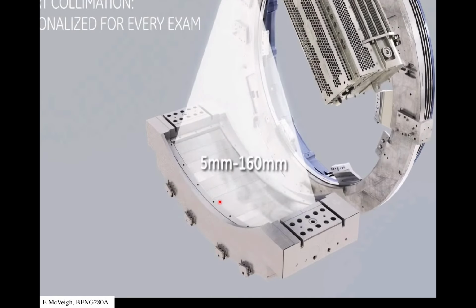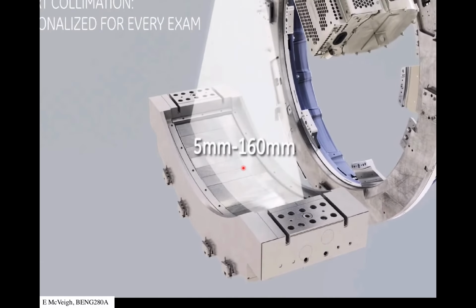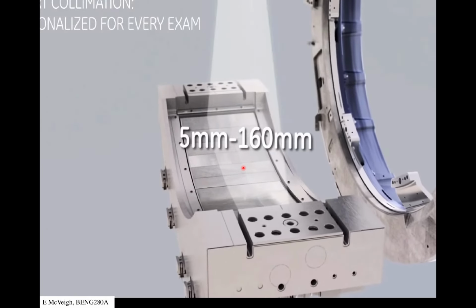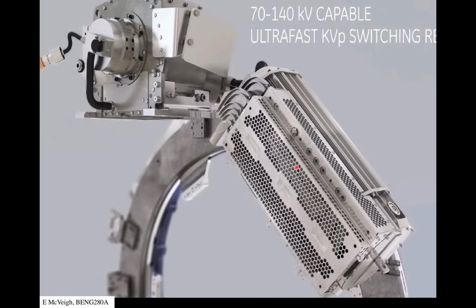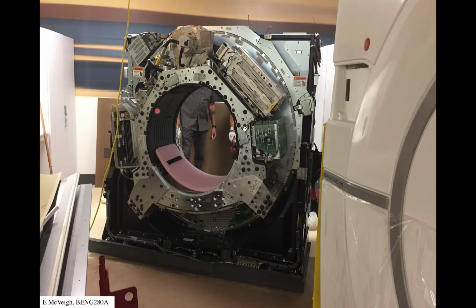So here's the detector in Z, 1,000 this way, 256 this way. Using a shutter system at the top of the source, you can narrow down your field of view to a smaller than the full 160 millimeter field of view. And there's the voltage source and the X-ray tube itself. That's what it looks like being installed.